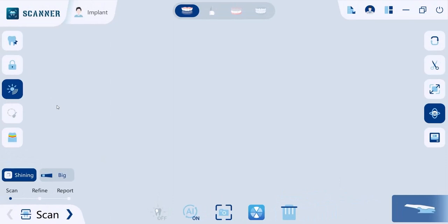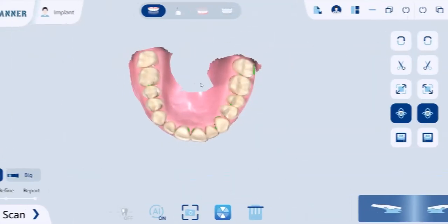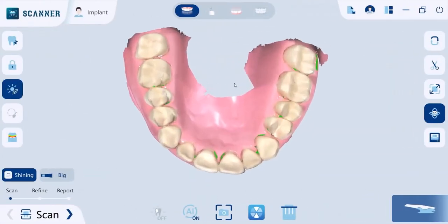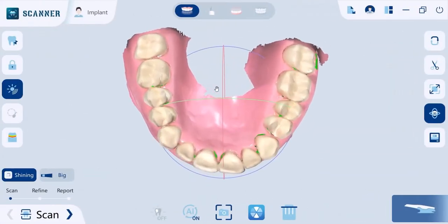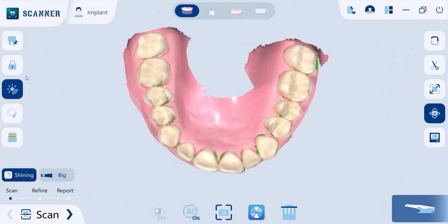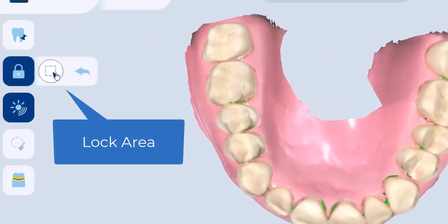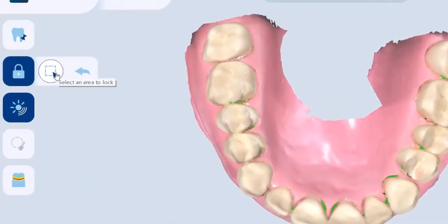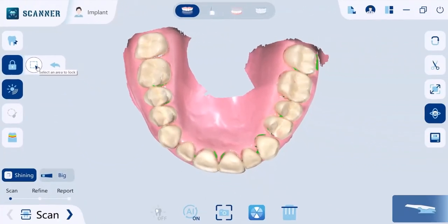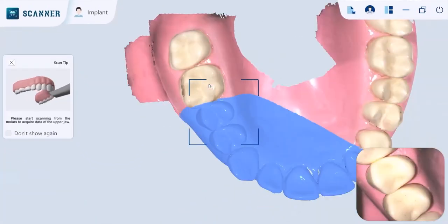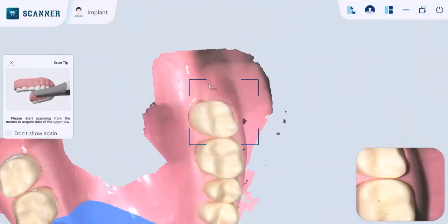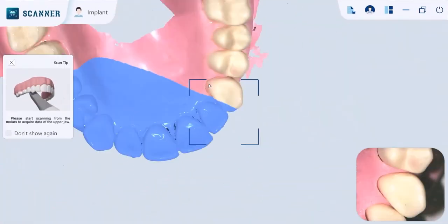During scanning, if you want to keep a certain area on the model without further updates, you can use the Lock Area tool to prevent it from being updated by additional scanning. As you can see here, the blue area does not change.